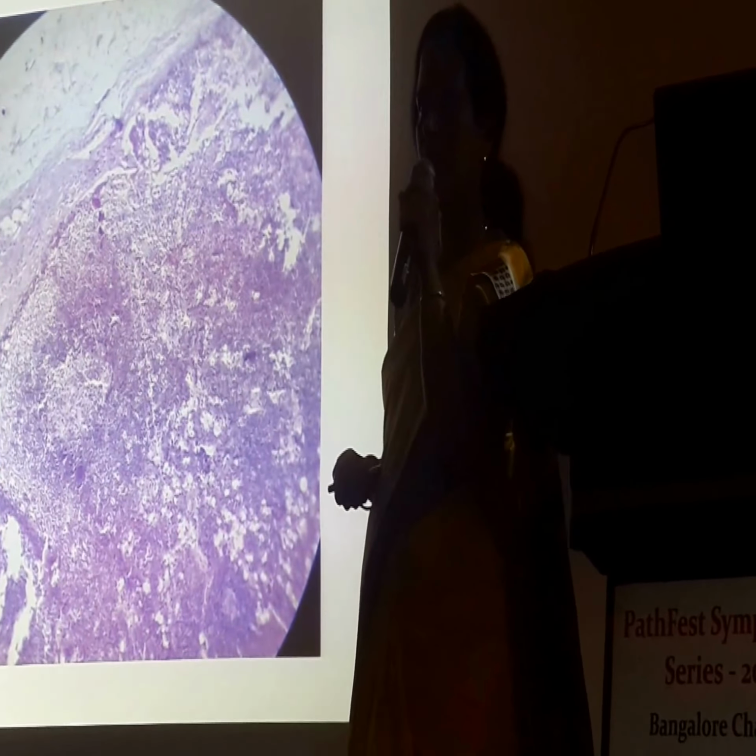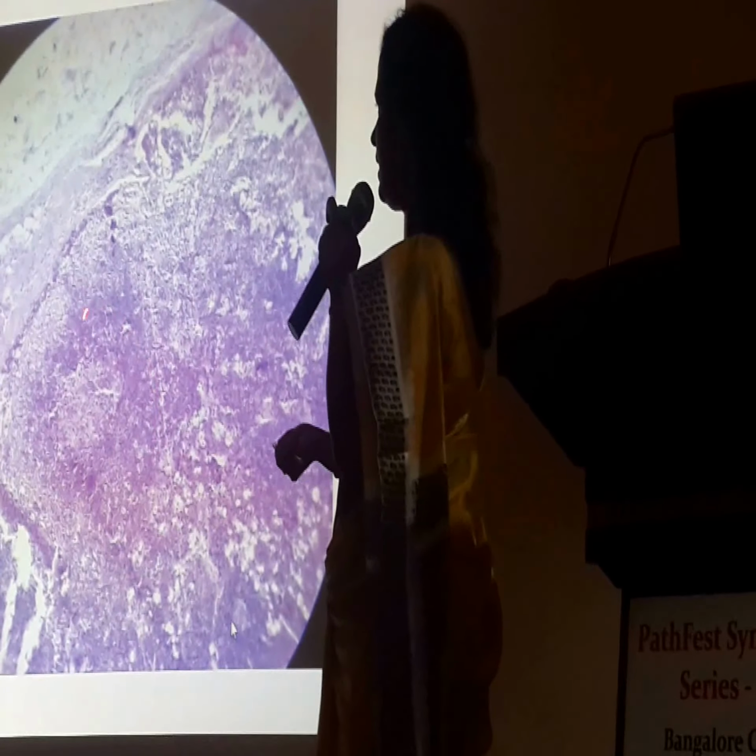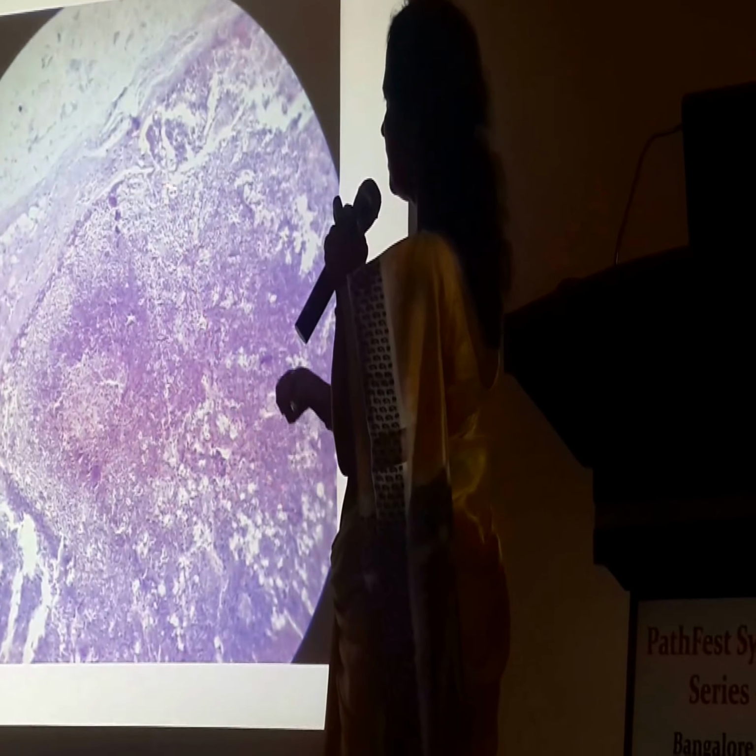Within the follicles, yes. So where are you seeing these cells here? Very good, paracortical.